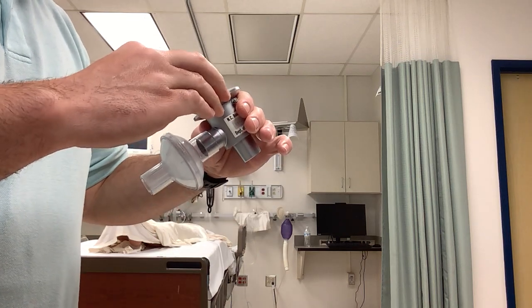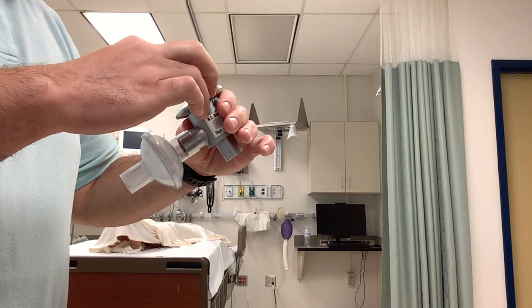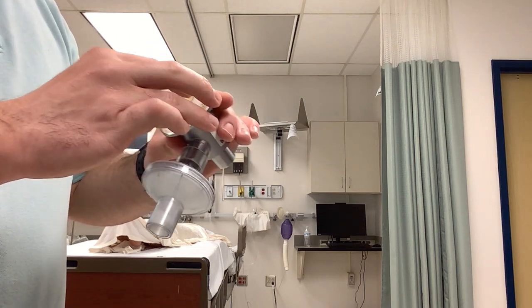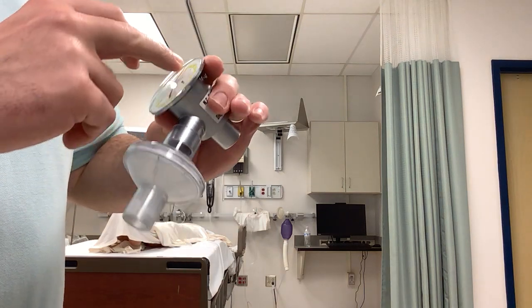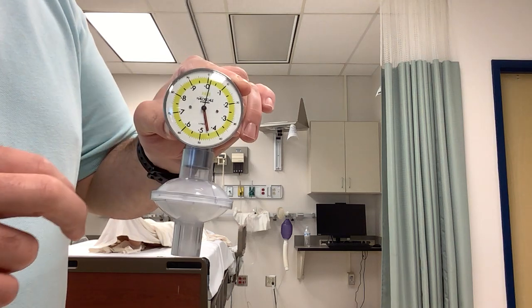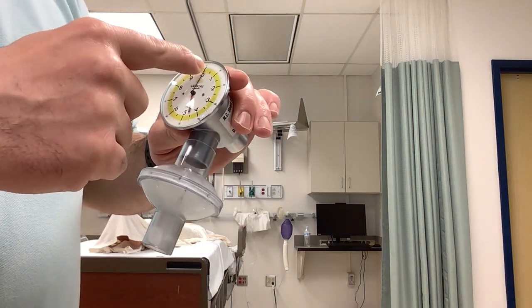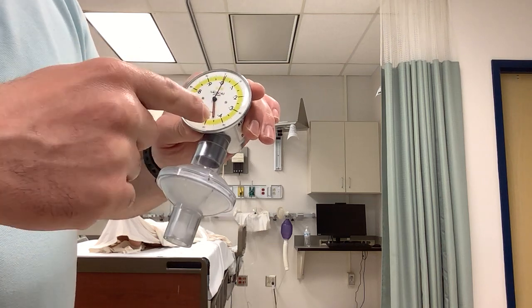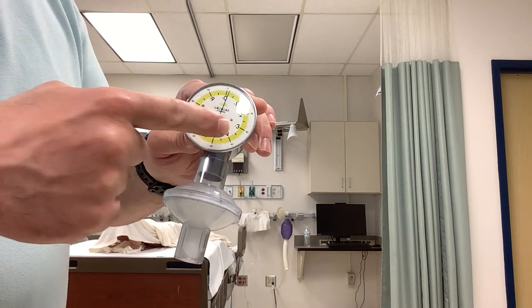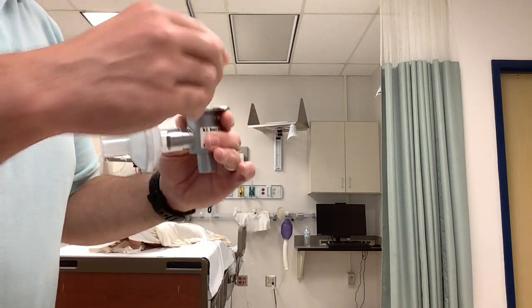So that little bit that I had breathed in there gets me to not quite 2 all the way around, so 1.45. This is about halfway between 1 and 2, so it would be 1.45 as we can see there. And you get 1 because it's in between 1 and 2 up here, and then the smaller needle is directly on 0.45. So 1.45 is what we've got there.